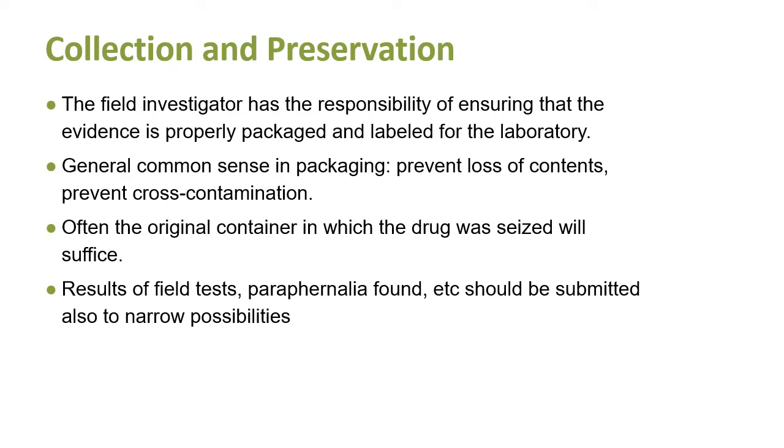We also need to be a little bit careful about safety of the person collecting it, especially with something like fentanyl, where in very small doses it can be absorbed through the skin and have a pharmacological effect. So the collector is actually at risk themselves. So we want to be careful of that as well. The original container it was in would usually be the correct container to leave it in, so that we're doing as little as possible, we're going to preserve it as it is.